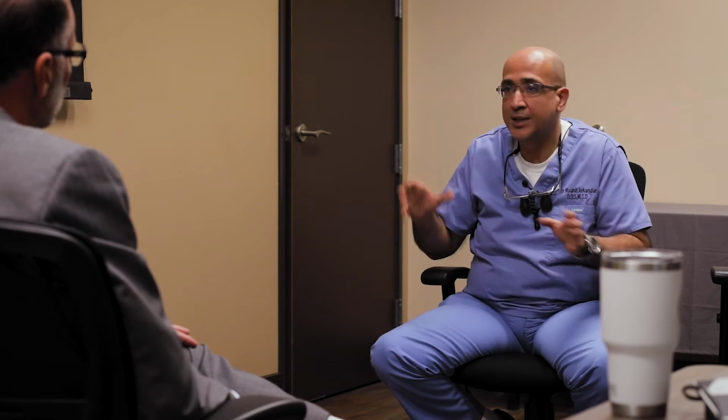Sometimes I can see it obviously from the beginning. I'm telling you, we are removing the teeth, placing the implant, and we give you a denture. Yes, this bad one that everybody hates, for about 4 months or so until the implant heals. Or I would tell them I have a 50-50 chance that it can happen. If I don't feel the implants are strong enough inside the bone during insertion, I might have to give you a denture. Or if it helps me out, I will give you the bridge.